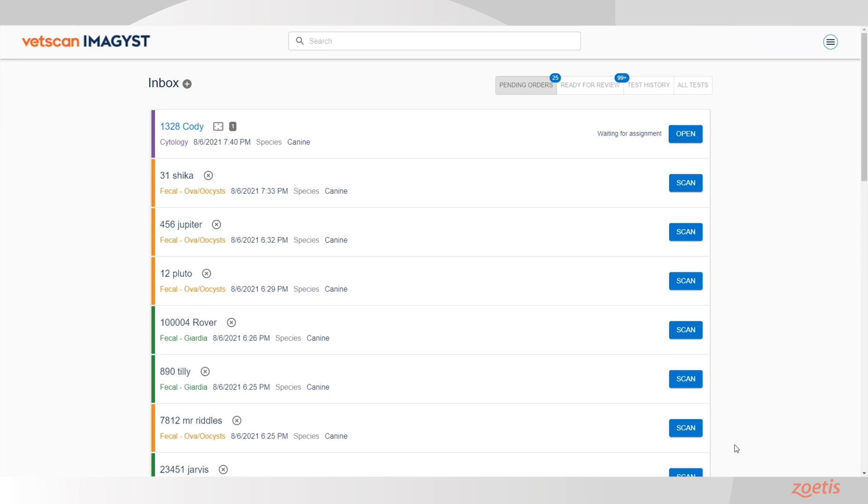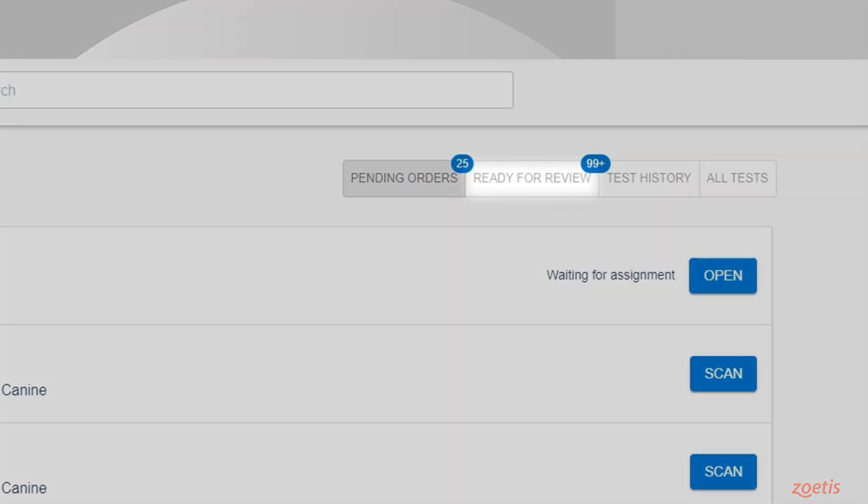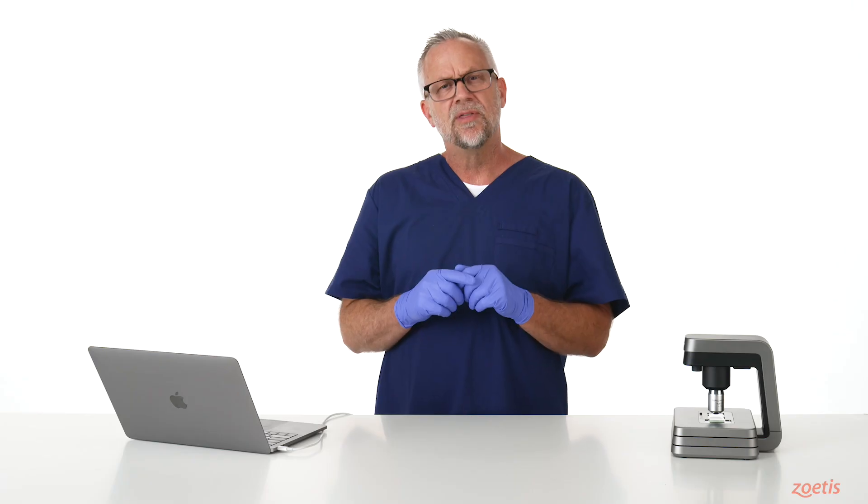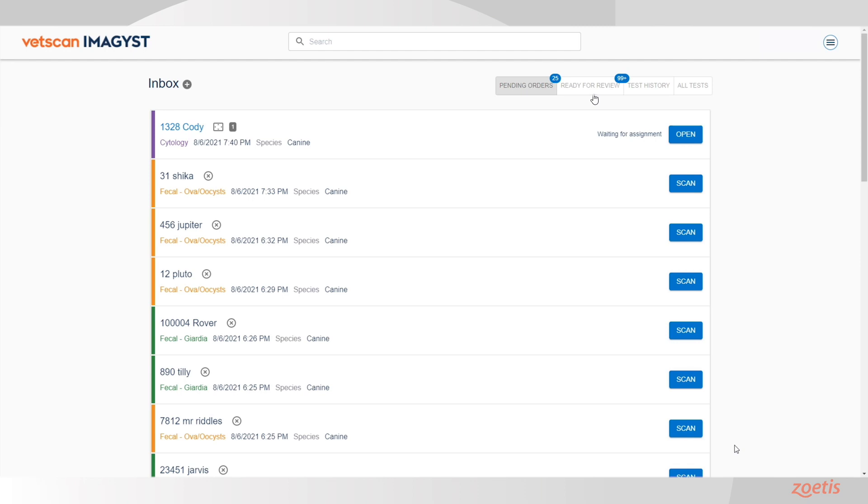Your test order has now been submitted. At the top of the inbox, you're going to notice four tabs. One is labeled Ready for Review. When a pathologist has finished reviewing your test order, the results will appear under that tab.